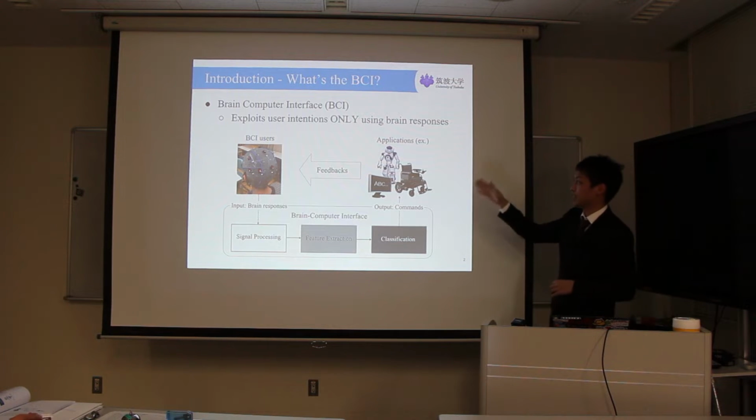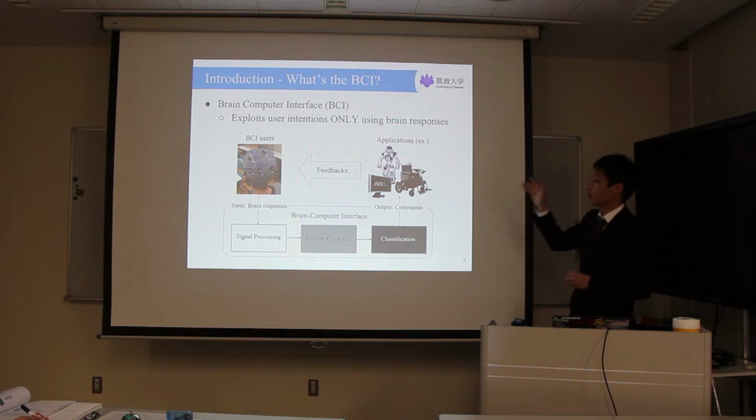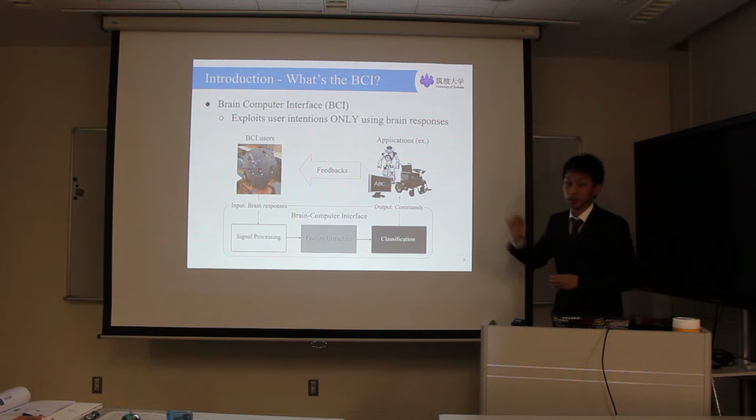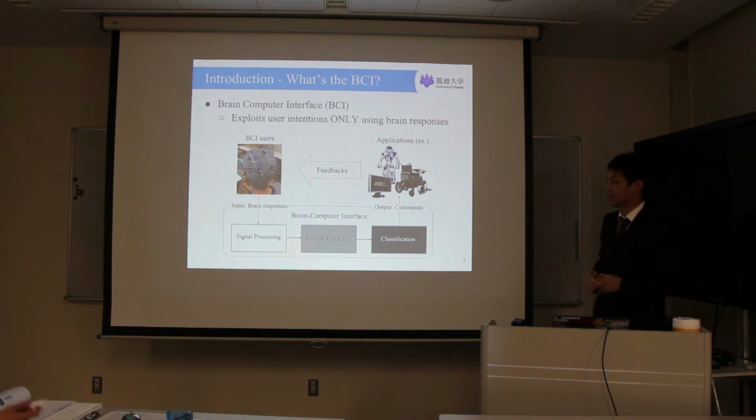The main purpose of these applications is to enhance human function or human movements, like a robot, a wheelchair, or a language system. Then these applications will give feedback to the users. This closed loop is the BCI's main function.